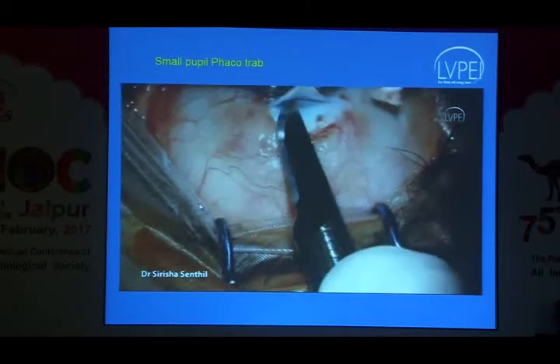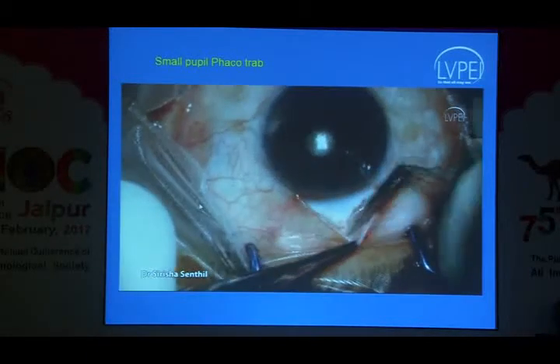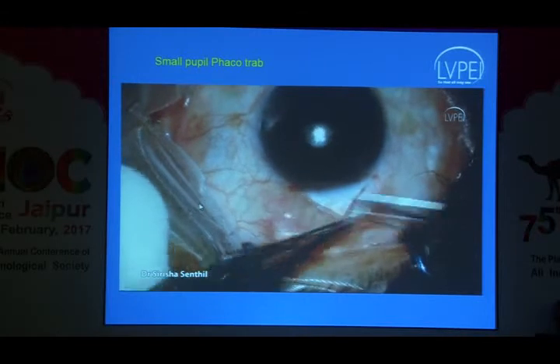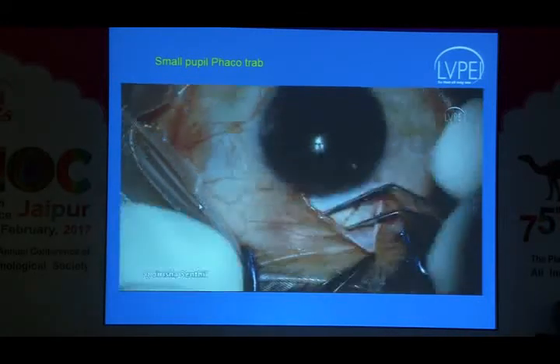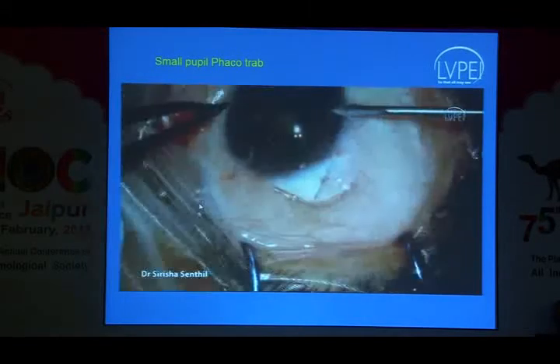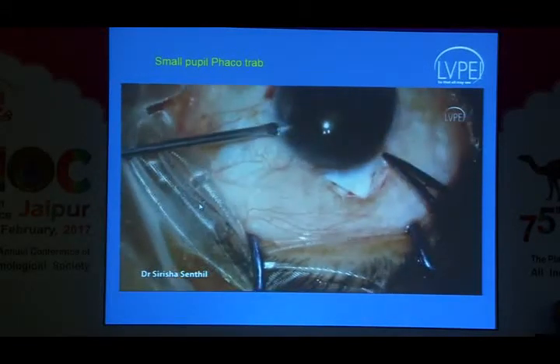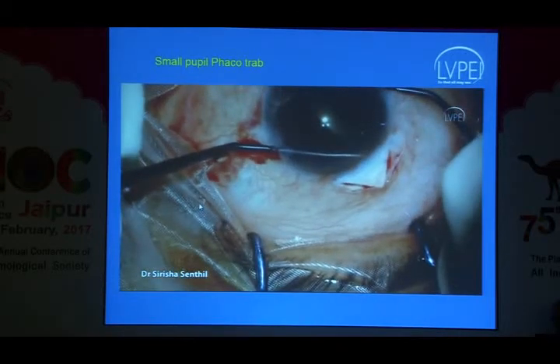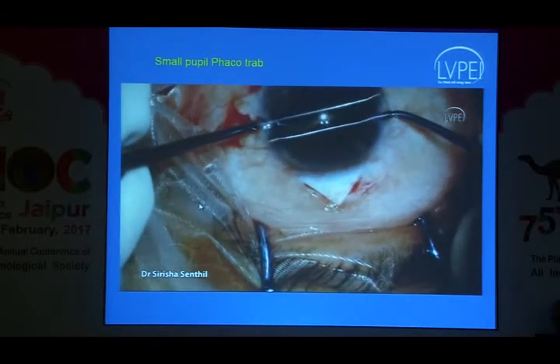I do a single site phacotrabeculectomy most often. My triangular flap size is relatively large. It's 4 by 4 millimeters. And after I make the flap, I use mitomycin, and once that is removed, I finish doing all of that before I enter the anterior chamber. Then I make the paracentesis, because I don't want the mitomycin to be used when I have opened up the eye. So this is using Kuglin hooks to dilate the pupil.